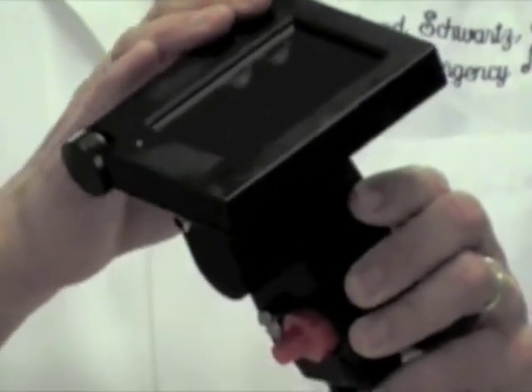After use, the handle of the video rifle should be wiped down with a topical disinfectant wipe as well.